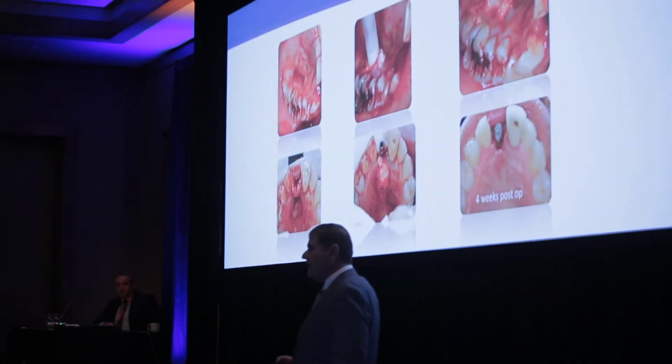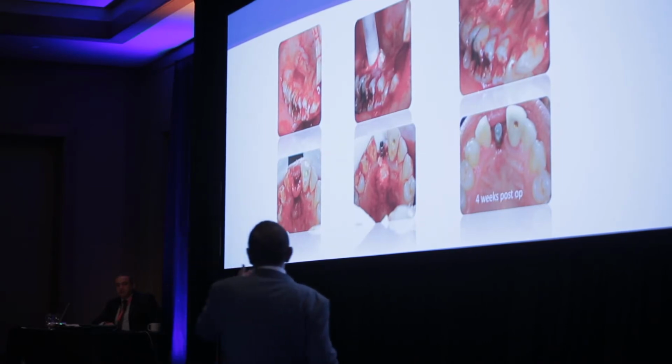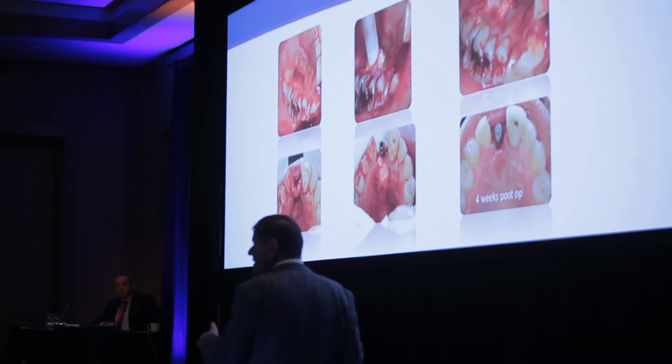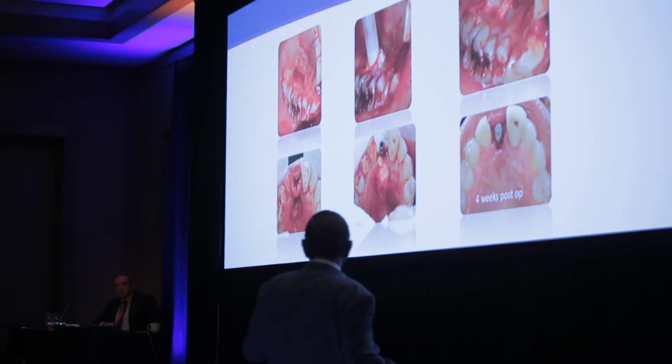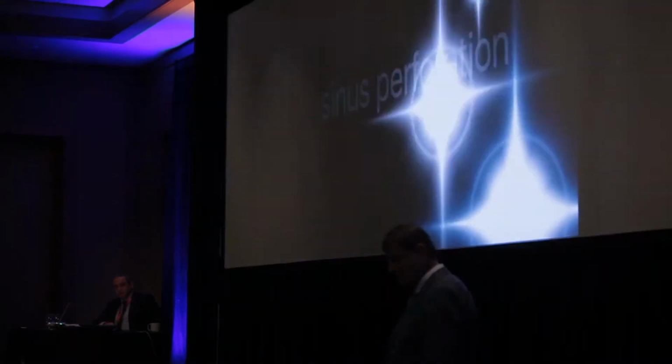We can use it as well when we take a free connective tissue graft. Now, we don't use it in that case for augmentation. I'm using for such cases the half cc, which is relatively not expensive. When there is abundant bleeding, I just place it, press it, stop the bleeding instantly. It saved me at least 20 minutes that I need to stay until it will stop. And you can see that soft tissue can proliferate very nicely in the area.